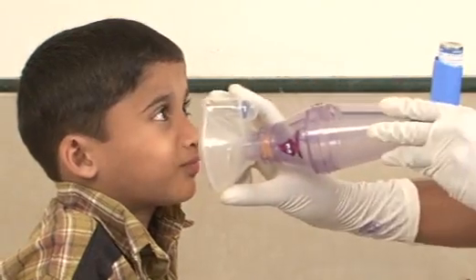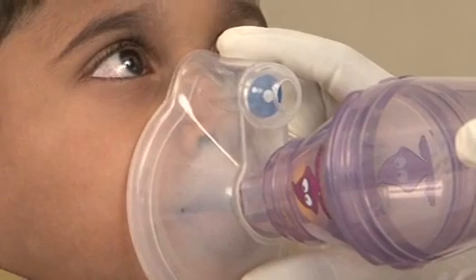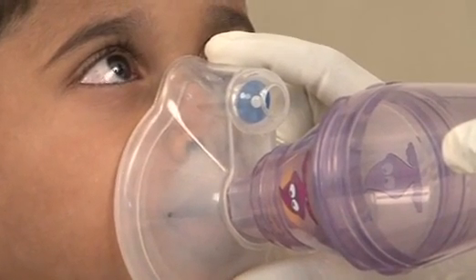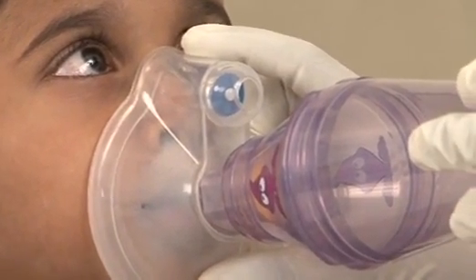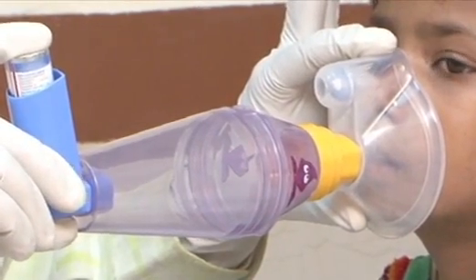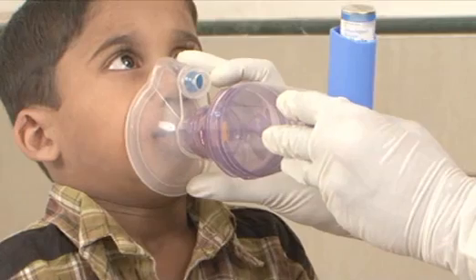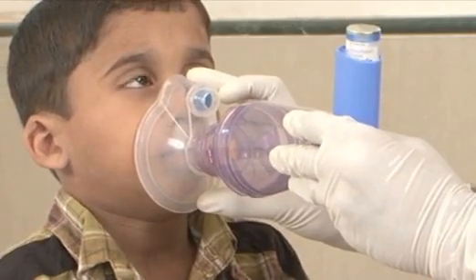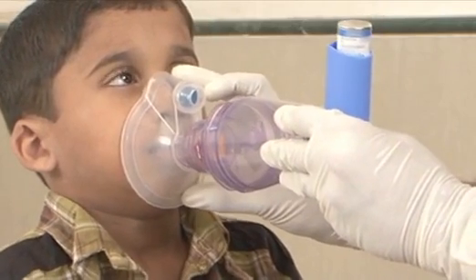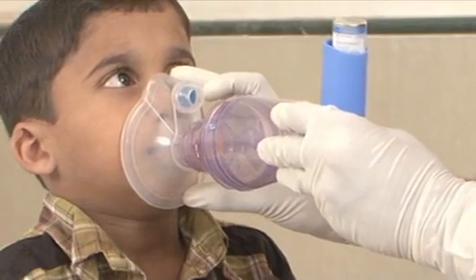Place the mask over the child's nose and mouth so that it seals the face properly. Press down on the inhaler canister to spray 1 puff of medicine into the spacer. Hold the mask in place and allow the child to breathe in and out slowly for 5 breaths.